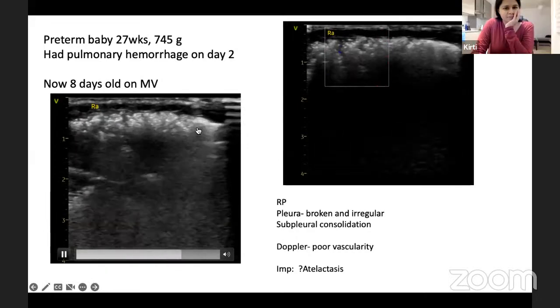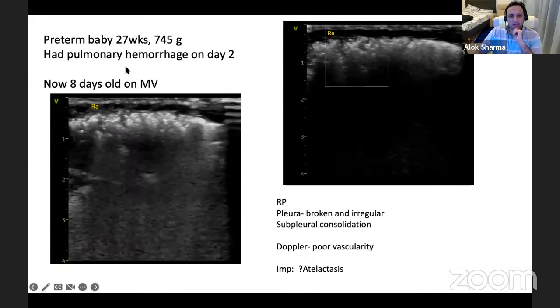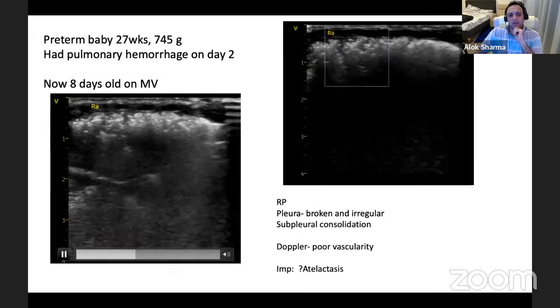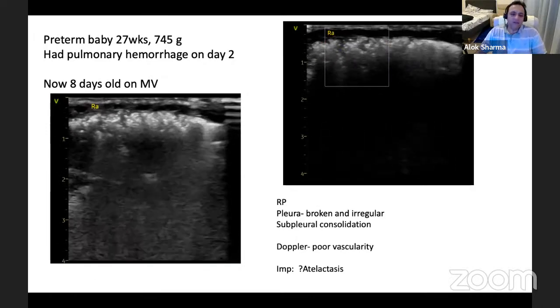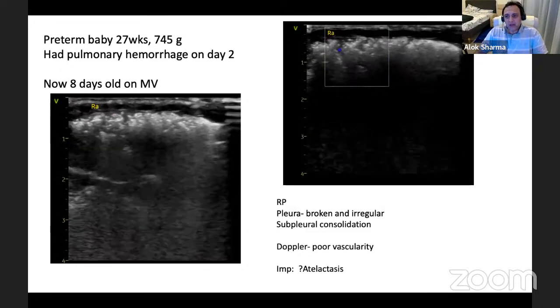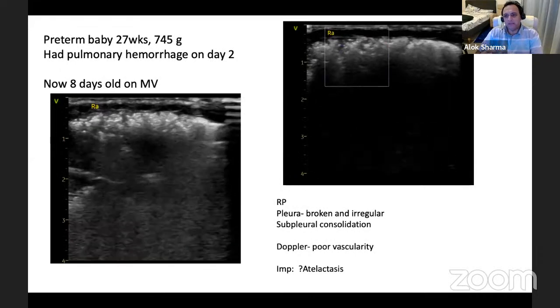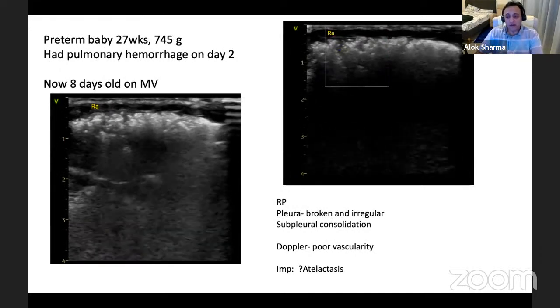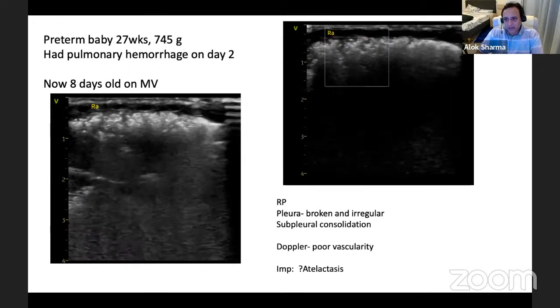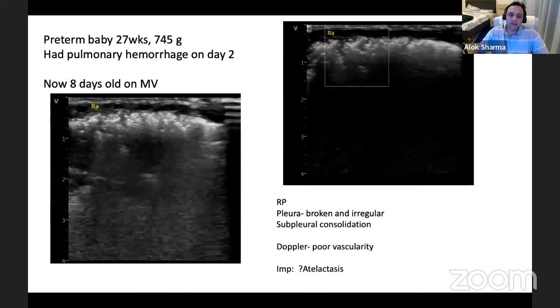Is that the lung pulse? Yeah, that's lung pulse on the right side where your arrow is. Can you just go back again? People sometimes misconstrue and think that lung pulse is only seen on the left side with the heart. It's not. You can see it on the right side as well, especially when you have a collapsed consolidation on the right side adjacent to the heart. If I look at the right lower lobe, when it's collapsed, the heart actually gets pulled towards the collapse, and that gives you a lung pulse.